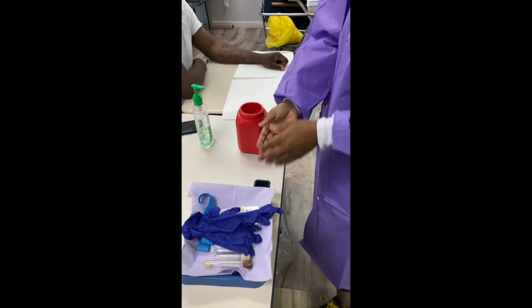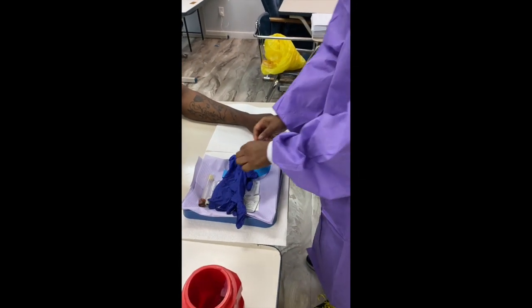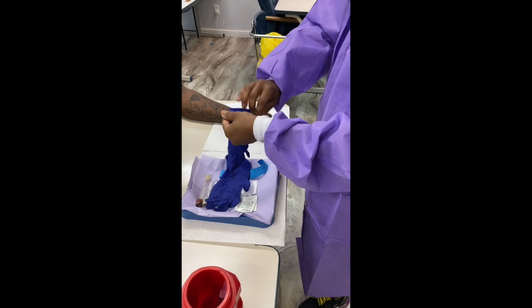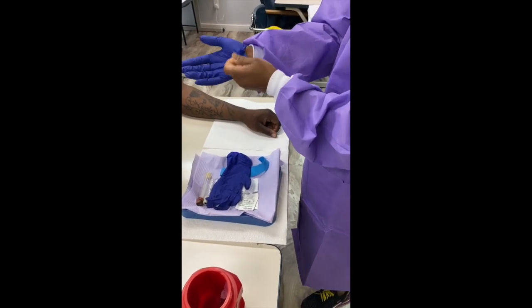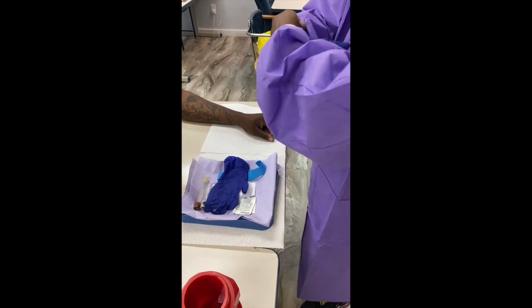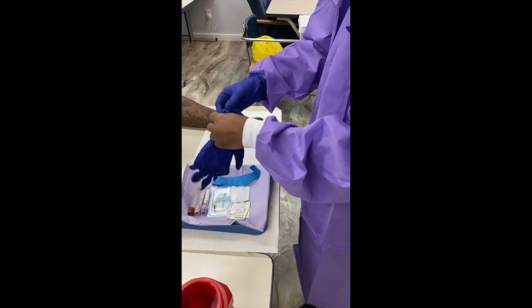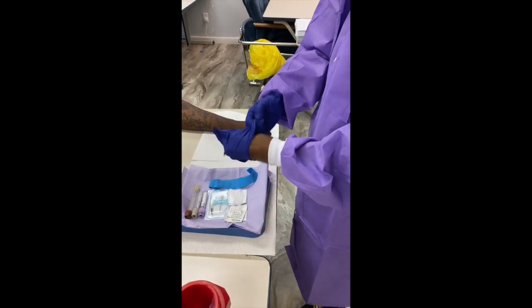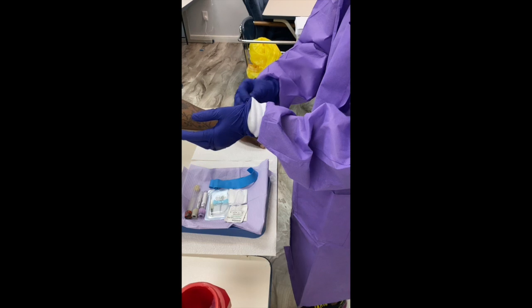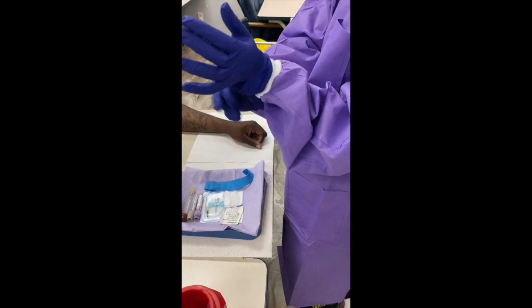Now that it's all dry, I can bring my supplies over and I'm going to get my gloves on. You would definitely know if you did not rub in your hand sanitizer, because you would have a very hard time getting your gloves on. I want to secure my gloves over my wrist, and now I'm getting my other one on — pulling it over the cuff of my jacket or gown.